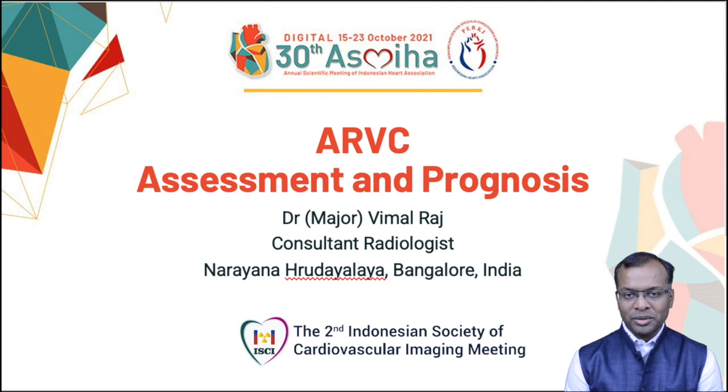Today, I'm going to be talking to you on a very important and interesting topic on ARVC, or arrhythmogenic right ventricular cardiomyopathy, the assessment and prognosis. I'm going to be focusing a lot on cardiac imaging, especially cardiac MRI.